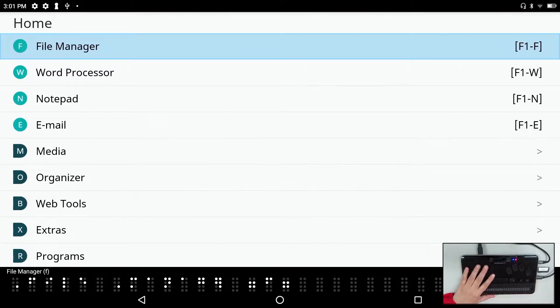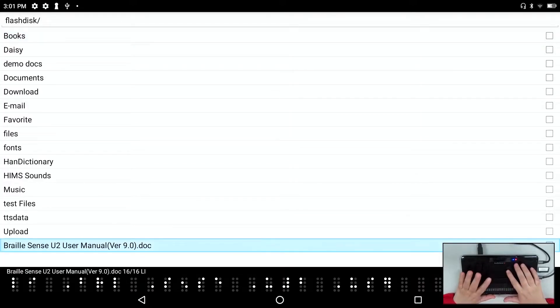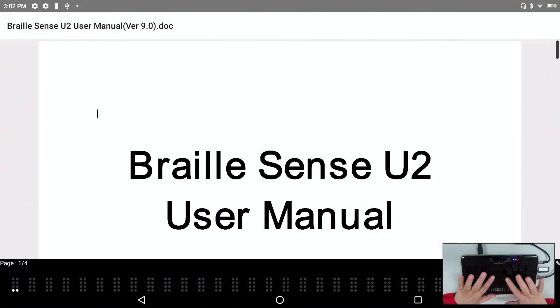Remember all that stuff about double storage, double RAM, upgraded processor, and Android 10? What does that mean in your practical world? Let's start with some speed tests. I'm going to open a really large file — the BrailleSense U2 user manual, which is about 460 pages. I pressed enter and as soon as it started to say 'BrailleSense U2,' it was already loaded. That is how quickly things load these days.